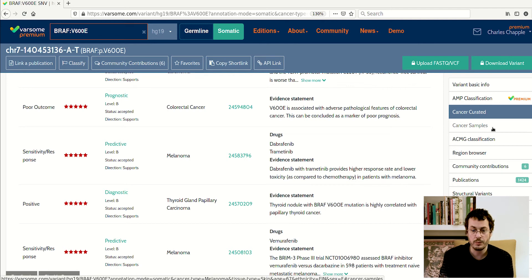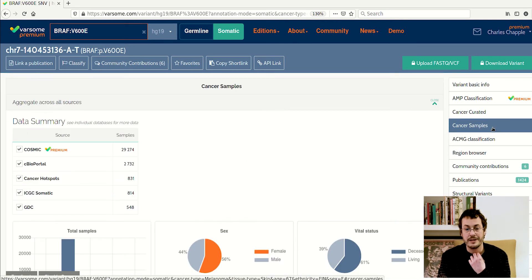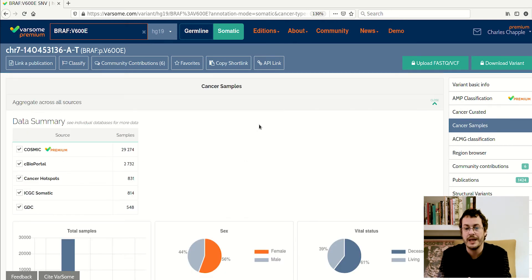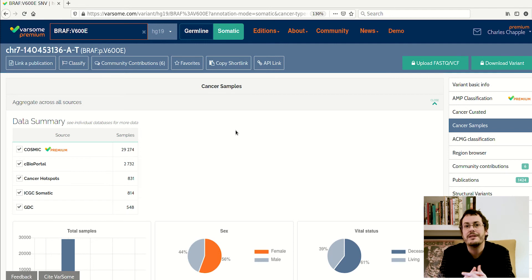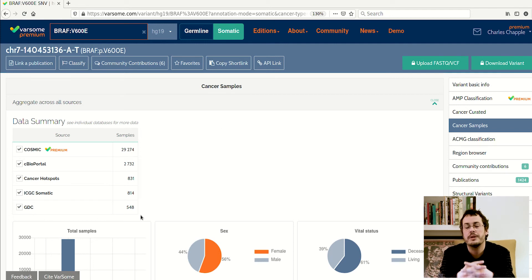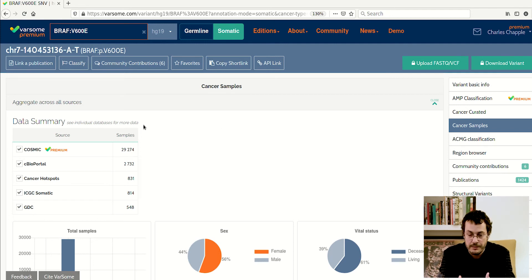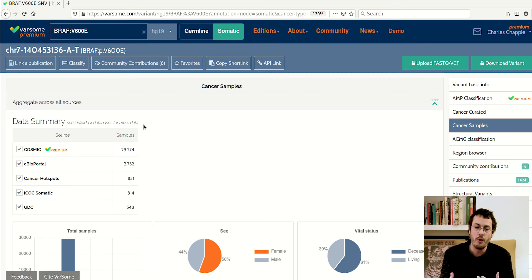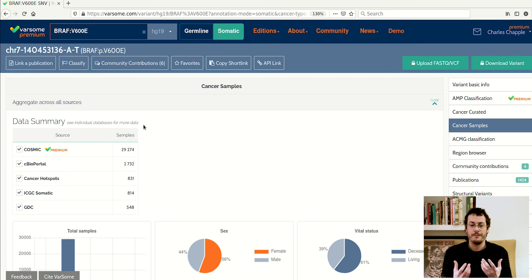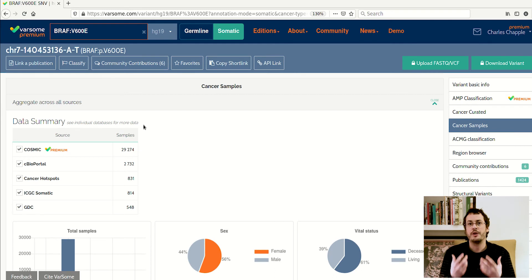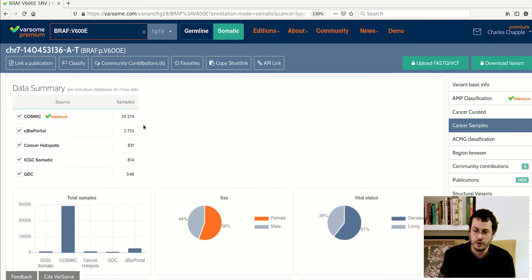Further down, what we have here is the cancer samples, and here we have information from databases that store real patient samples and clinical information about these patients. Here you can see how often your sample matches those that are in these other databases.